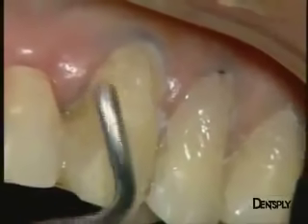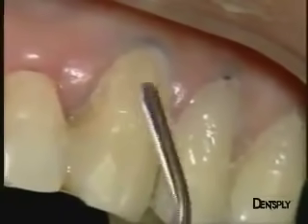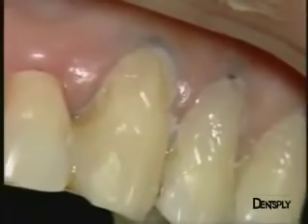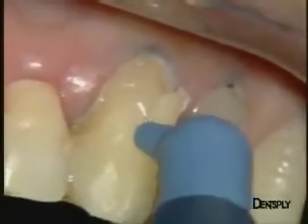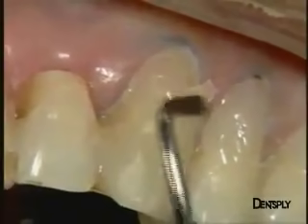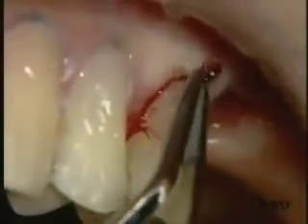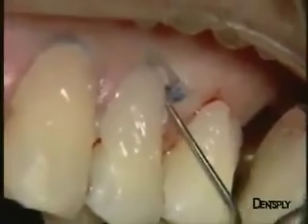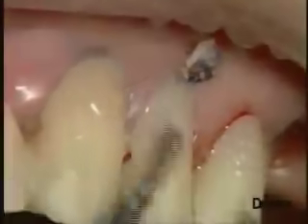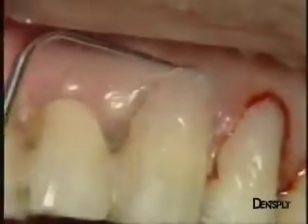A final layer completes the filling of this canine. Gross excess can, of course, be removed later with finishing burrs. It is always important for the anatomy of this type of filling to reconstruct the convexity in both mesiodistal and occlusocervical directions. The retraction cords are then removed, and you can see that some excessive adhesive is eliminated at the same time. Some gingival bleeding occurs when the cords are taken away.